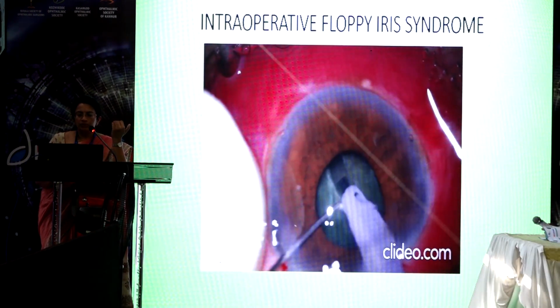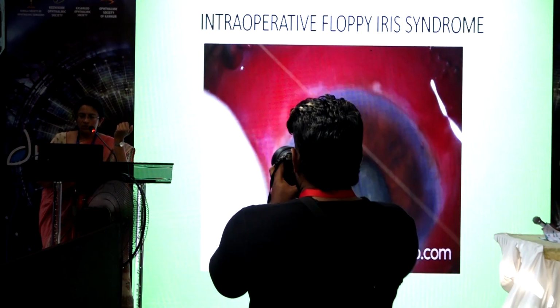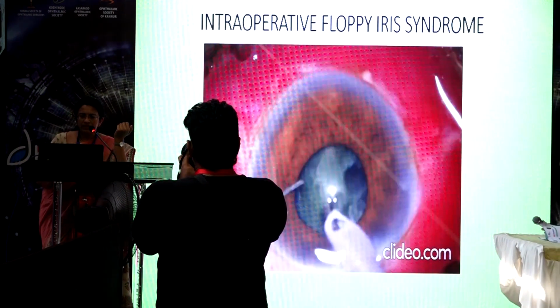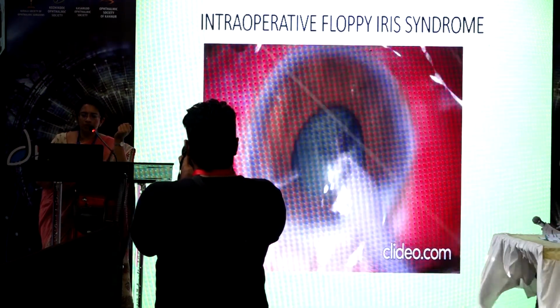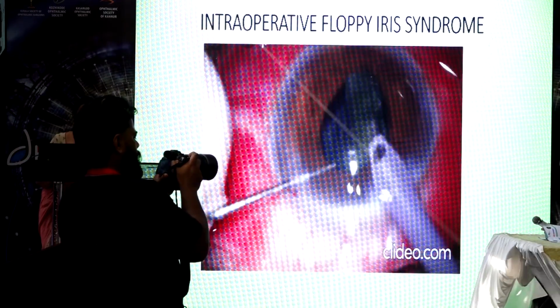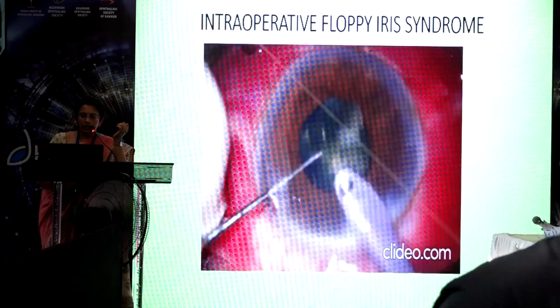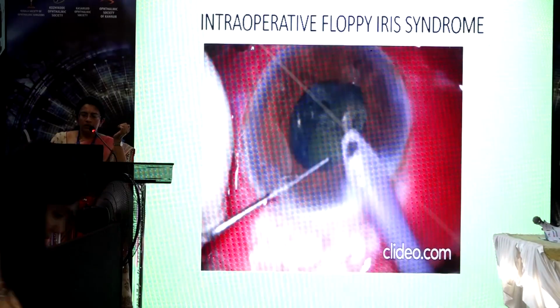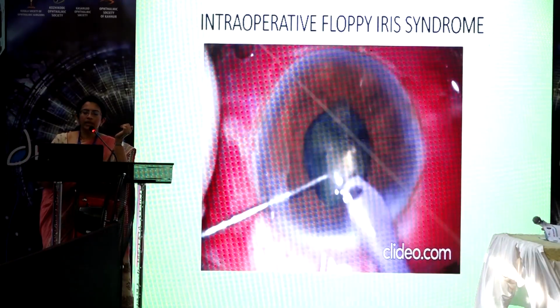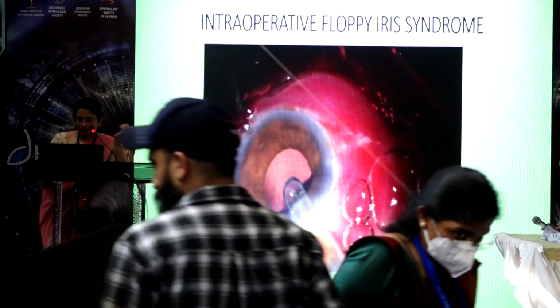During this the pupil further came down, and somehow I took out these nuclear pieces through the small pupil. Luckily the nucleus was not very hard, so I could take it out. In this case I coated the endothelium with viscoelastic, because I was doing an anterior chamber phaco, to protect the endothelium, and somehow there were no complications, and I could place a lens inside the bag.